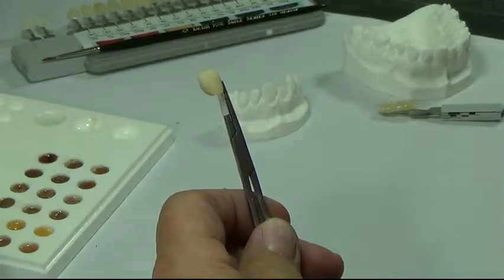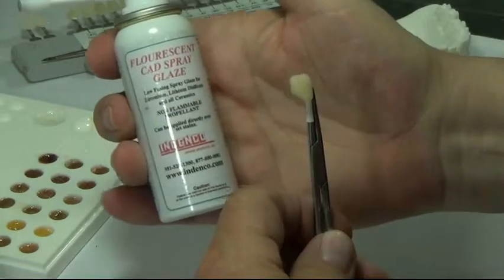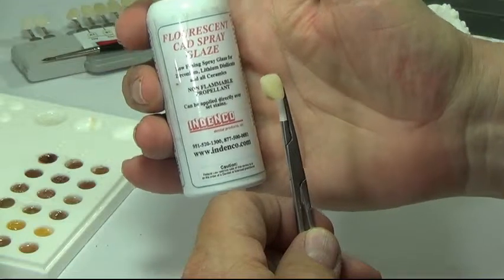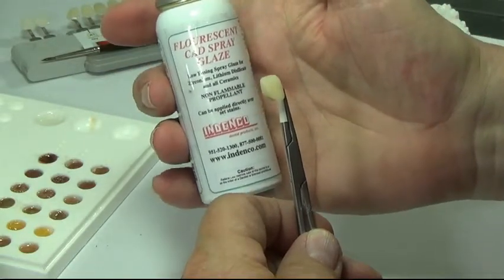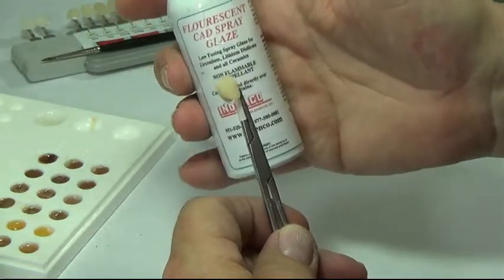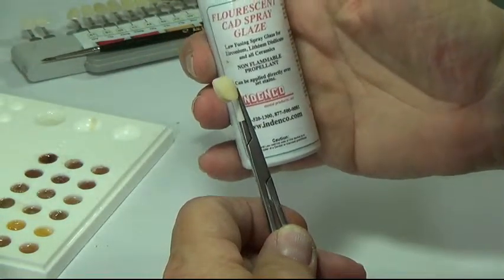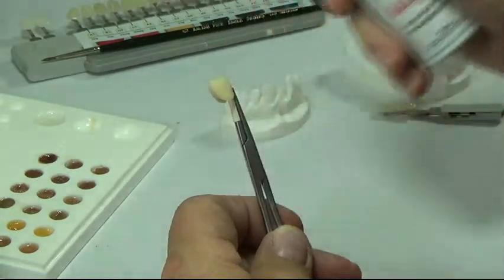Now we've evaporated the liquid, taking the shine off of it — that's all that's necessary. Here's our fluorescent spray glaze. Two or three little short bursts, putting on a thin dry coat as it goes on very dry, so it won't disturb the unfired powder below. Then we'll put it on the peg, check the inside of the crown to make sure we don't have any glaze inside, and fire the crown.